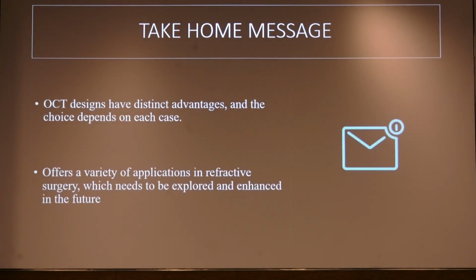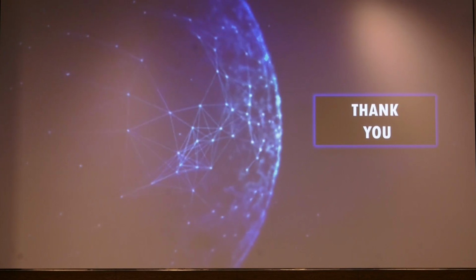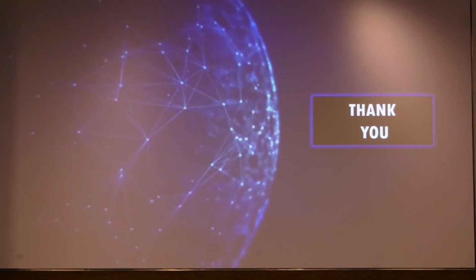So the take-home message would be that the OCT designs have distinct advantages and the choice depends on each case. It offers a variety of applications in refractive surgery which need to be explored and enhanced in the future. Thank you.